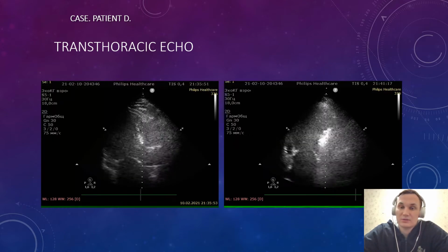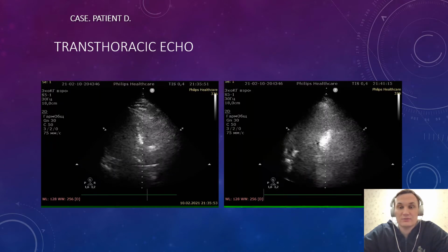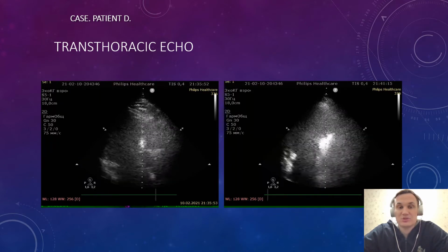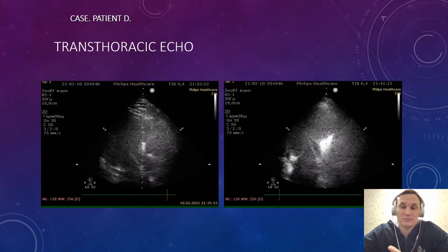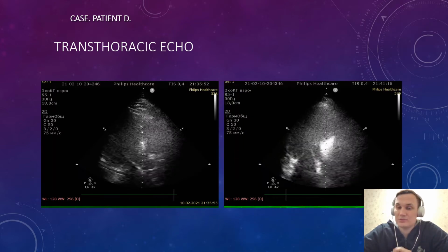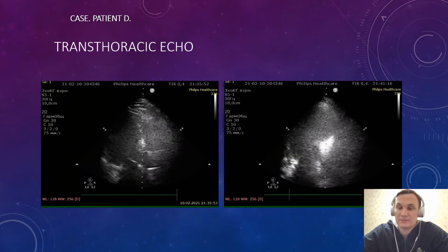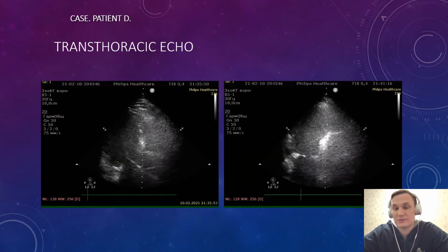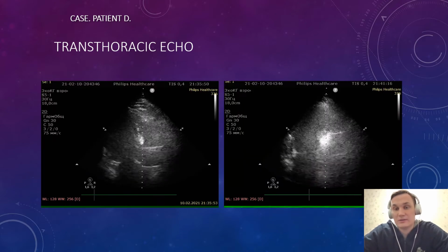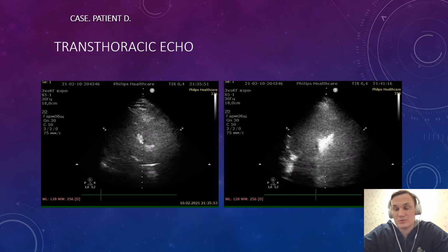And you can see how it looks. In this patient we bumped into just the LVOT vascular bed supplied from this target perforator, and that's why we decided to ablate it.